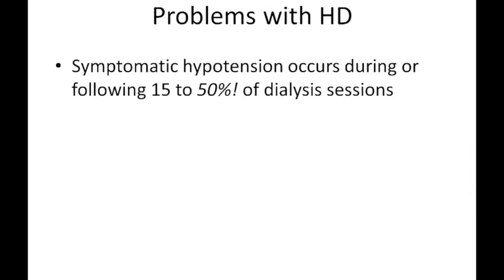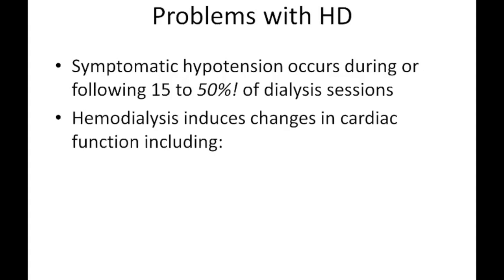And generally, this comes down to hemodynamic stability and cardiac stunning. We know that hypotension to some degree occurs, depending on the study you look at, in up to 50% of dialysis sessions. And obviously, if you're dealing with a patient that's already hypotensive, this is an adverse effect we're certainly looking to avoid. We also know that cardiac stunning occurs, as I mentioned.